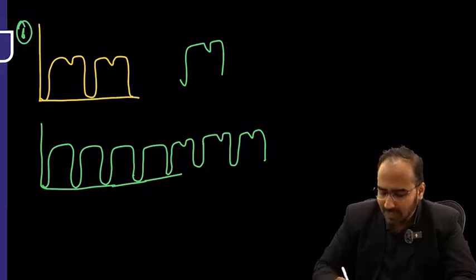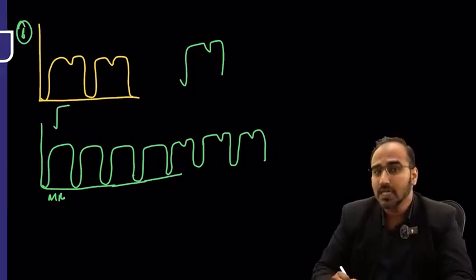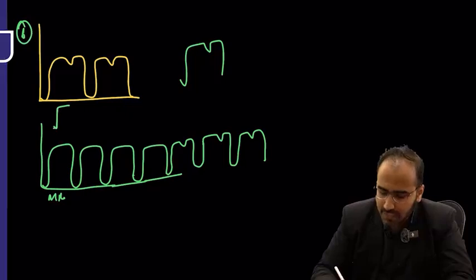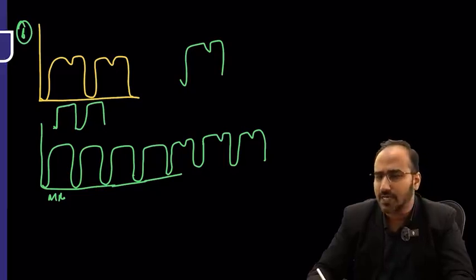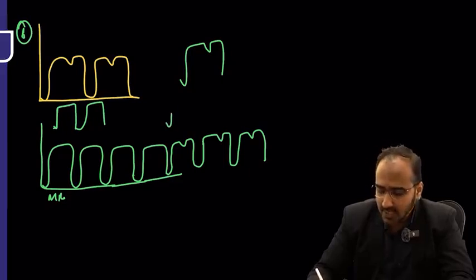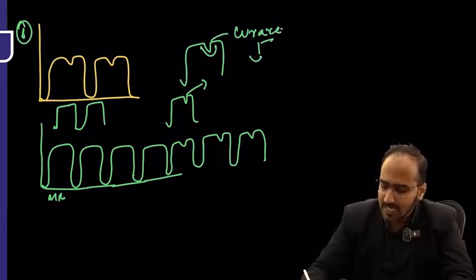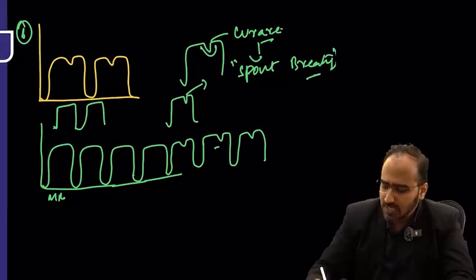What is happening guys? Remember this patient was fully paralyzed under the muscle relaxant effect. When he is fully paralyzed, there won't be any patient efforts. So you will see a flat or smooth capnography in the alveolar phase. But after 30 minutes, the effect of muscle relaxant is gone. Now slowly there is an effort from the patient. This notch that is developing is called the Curare notch. That means the patient has returned to spontaneous breathing. Return of spontaneous ventilation gives you this Curare notch.